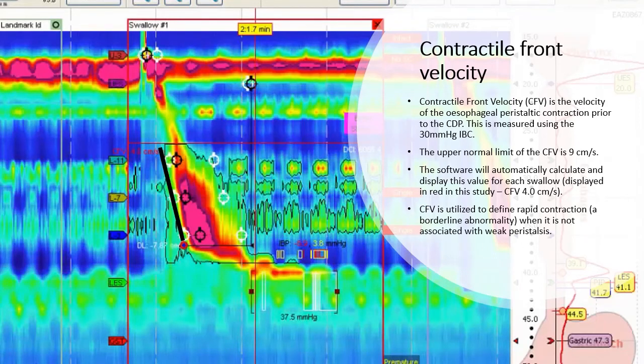The software will automatically calculate and display this value for each swallow. Displayed in red in this study is the contractile front velocity of 4 cm per second. The CFV is utilized to define rapid contractions, a borderline abnormality, when it is not associated with weak peristalsis.